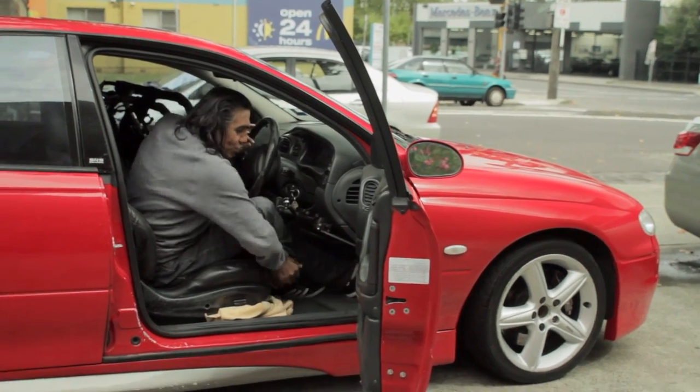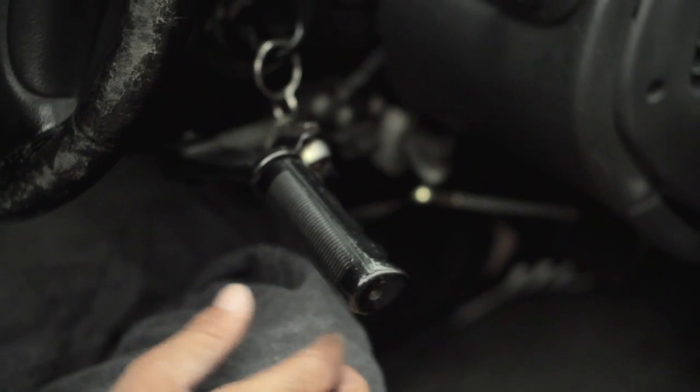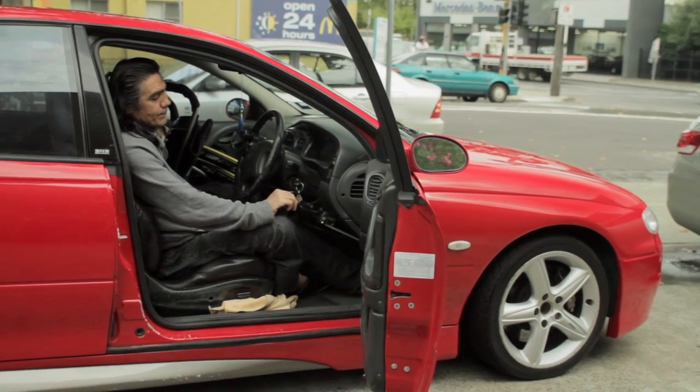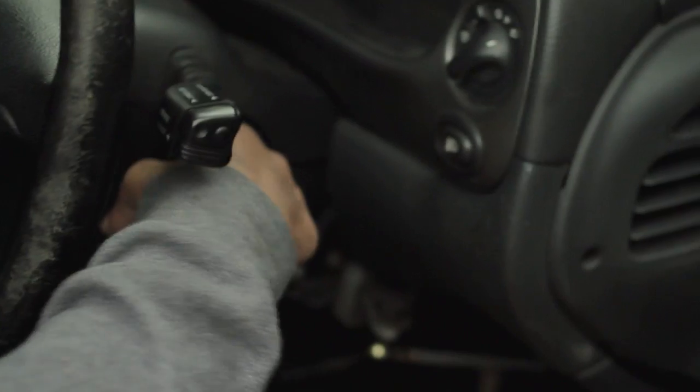Once I'm in the car, I use these things called hand controls, and this is pretty much it. Most cars use the same system. I'll start the car and show you how it works.